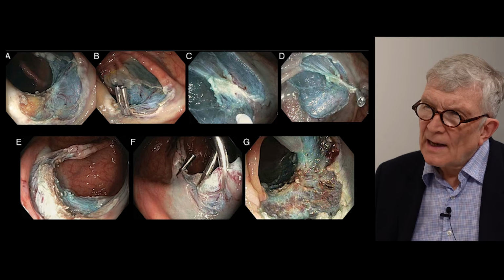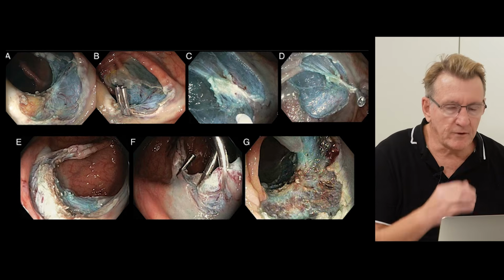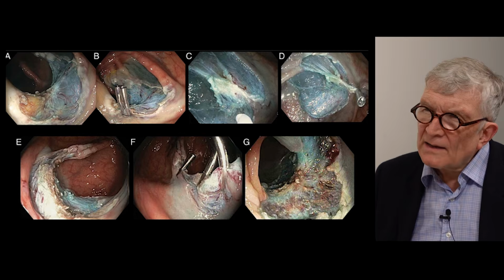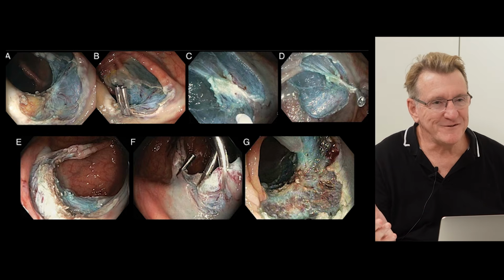So it mostly happens in treatment of recurrences or in fibrosis for whatever reason, but probably not in a normal polypectomy. So if you see that, you have used too much current, or you were too long. You don't generally see it.